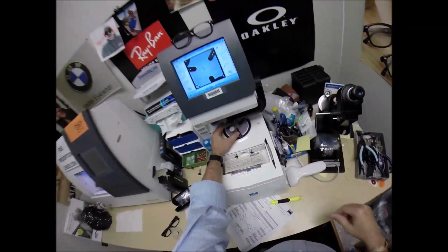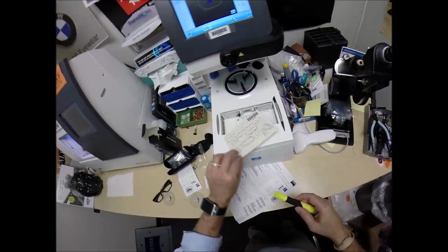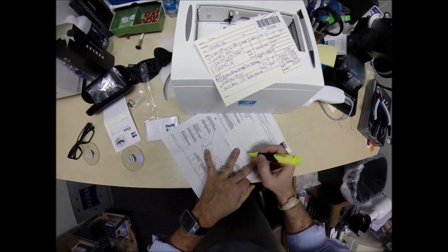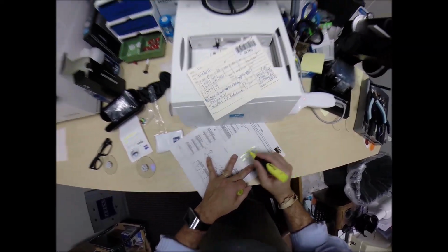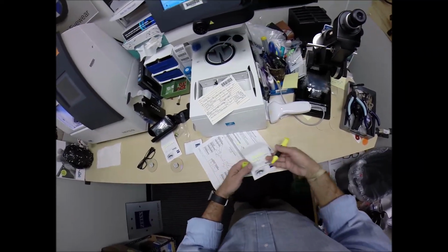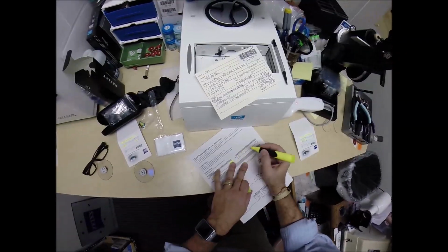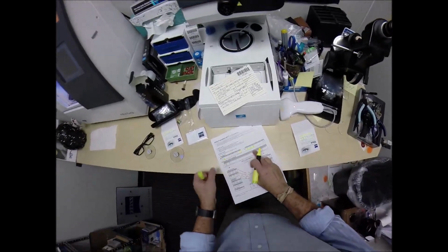One of these years. So I place the block onto the left lens. Let's highlight the prescription. -50, -75 at 86. Your progressive power. The Zeiss information, same thing on this piece of paper. Did I do it wrong? Oh yeah, -75, -75 at 86.